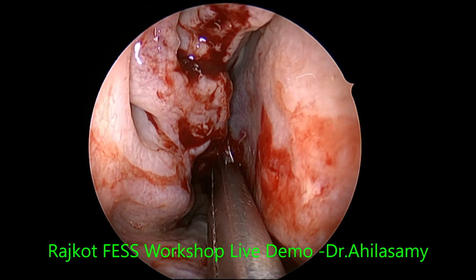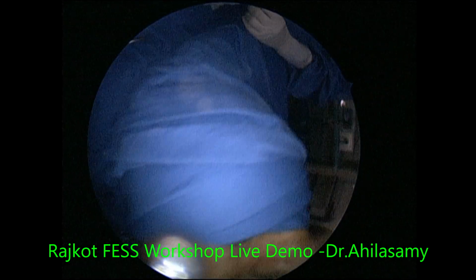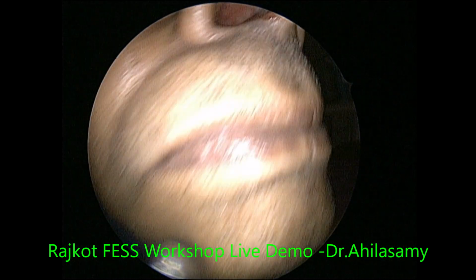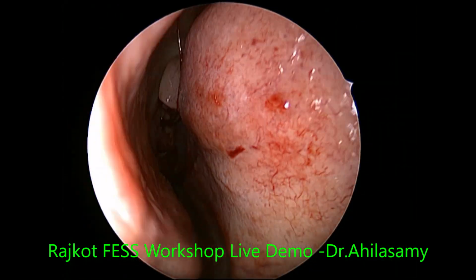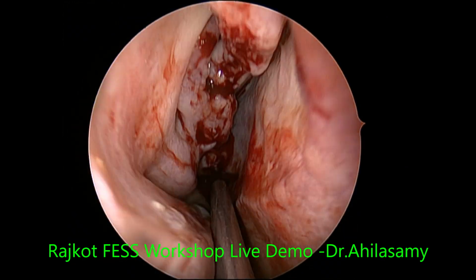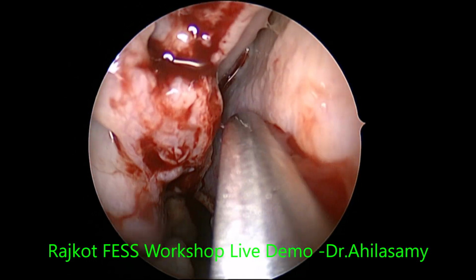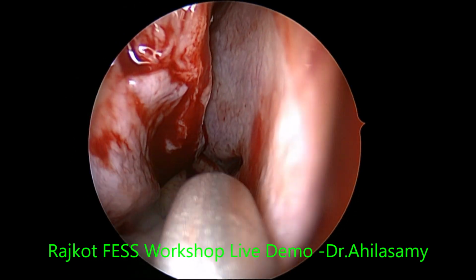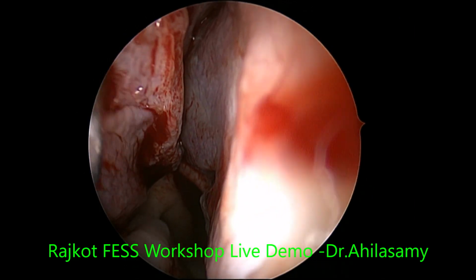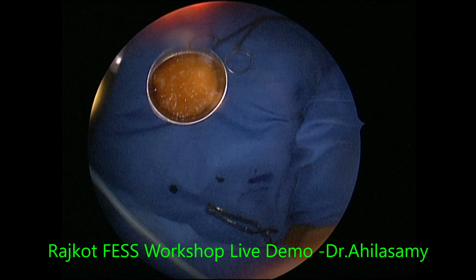It will cause a tear of the septal branch of the sphenopalatine artery, and never allow the turbinate to slip into the choana, which has happened a few times in my previous patients. They swallow, they may spit. Sometimes it's dangerous if they aspirate. So a little remnant of the middle turbinate is there, which I will take out with the shaver. Try to avoid injury to the septal branch of the sphenopalatine artery.